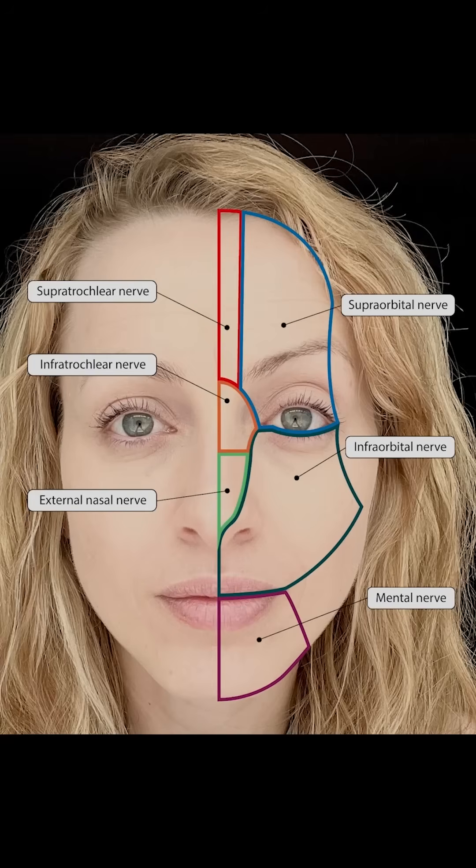An infraorbital nerve block will anesthetize the skin of the face from the lower eyelid down to the upper lip. It's a great block for any painful procedure of this region, which is commonly a laceration repair.